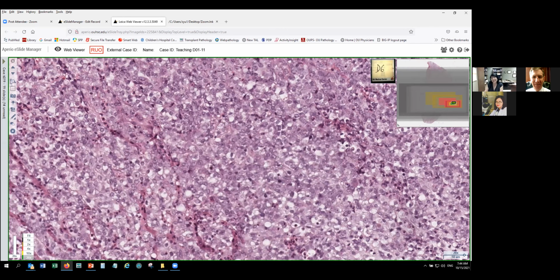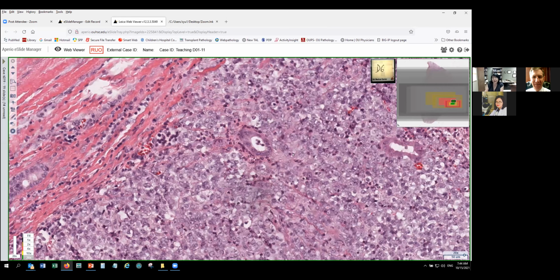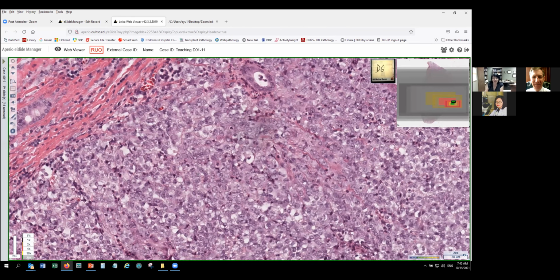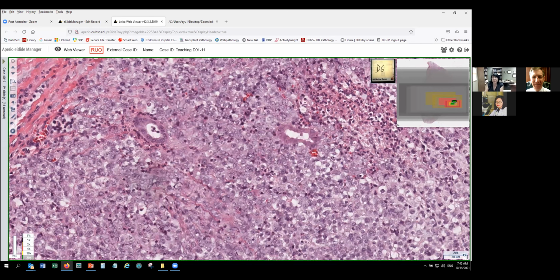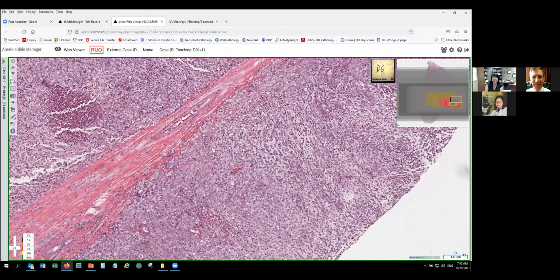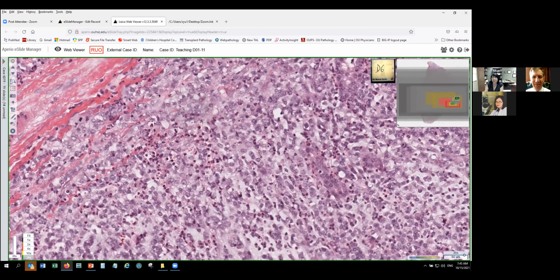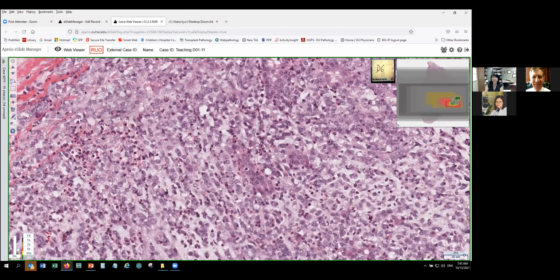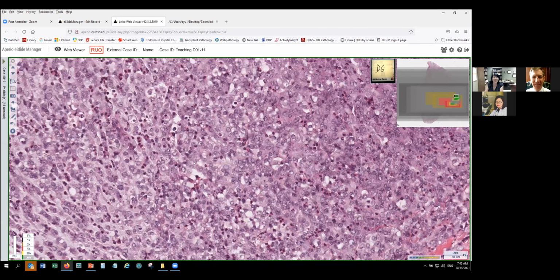Not blue, this actually is pink. We are looking at the pink cells. But unlike the first 3 cases, which have epithelial appearance, this one does not have much epithelial appearance. There's an entrapped bile duct. So infiltrative, small cell appearance. And some areas have a mixed solid background, and some areas have necrosis, neutrophils. But you really cannot tell from this histology what type it is.